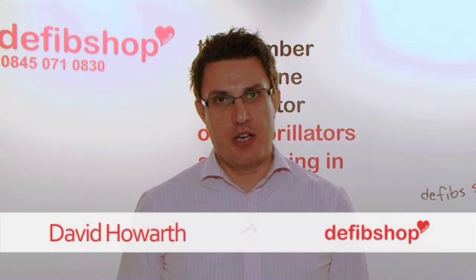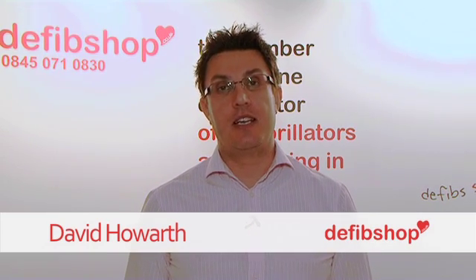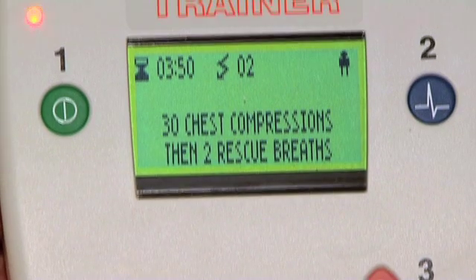This short demonstration video is for the Schiller Fred Easy Port, the smallest defibrillator in the world. The defibrillator is semi-automatic but comes with optional manual override and manual ECG. It comes with a 5-year manufacturer's warranty, a standby battery life of 5 years, and the electrode pads have a standby shelf life of 2 years.